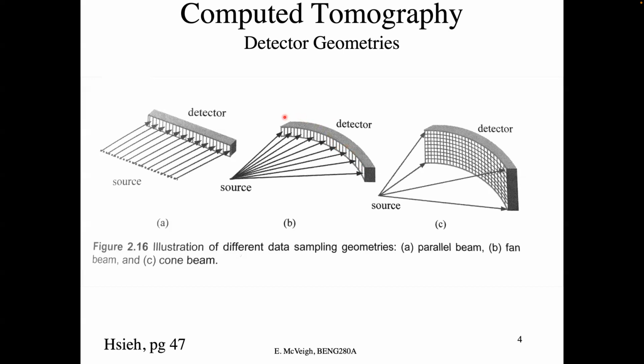For many years, the center to center distance between these detector elements in CT detectors has been 1 millimeter. It really hasn't changed much over about 25 years, as that has been considered good enough. What has changed is the fact that they stack many more of these things on top of each other. Over the last 20 years, this dimension has increased by orders of magnitude.